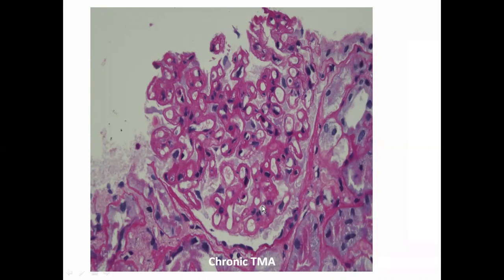Now, in an elderly patient, if you find kappa dominance and no lambda, you should suspect some kind of monoclonal pathology also. Normally, IgA is a disease of young and middle-aged people. So it is not that you can't see it in an elderly population, but yes, in an elderly population, if you find IgA and kappa dominant, think of that. In a young patient, if you find IgA kappa, think of secondary IgA. HSP nephritis will show more kappa staining than lambda. Primary IgA will show more lambda staining.